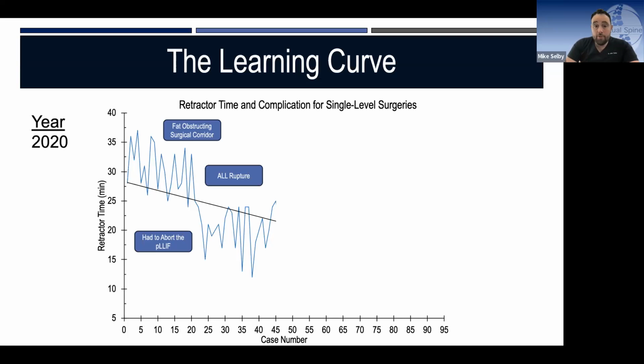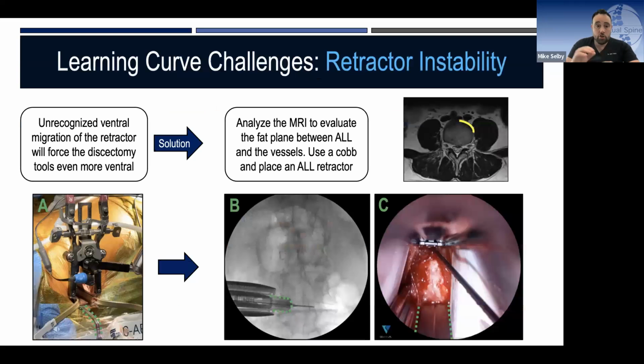I know you broke up a bit there, but when we were talking about retractor stability, I tend to use a shim if I'm worried, and I use a single docking port. But we have a second docking port available, so we can use double arm. Do you use double arm routinely or only in larger patients? Is that something you've done, using actually 2 retractor arms?